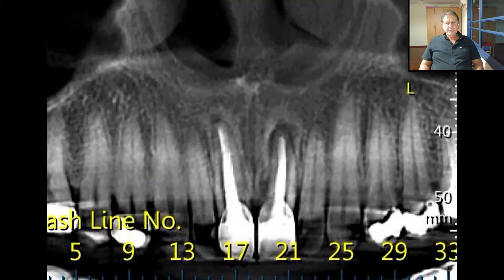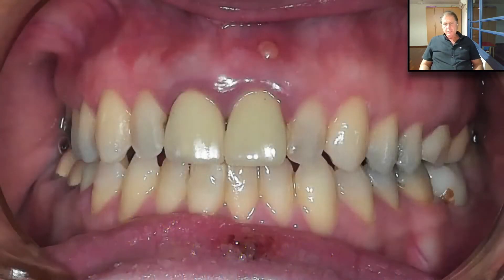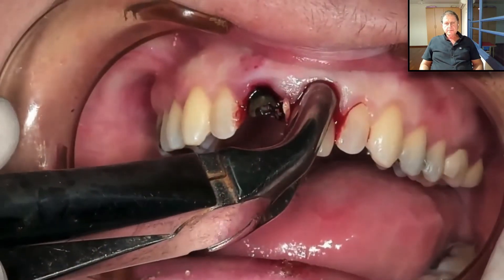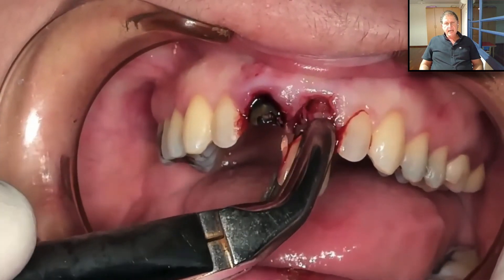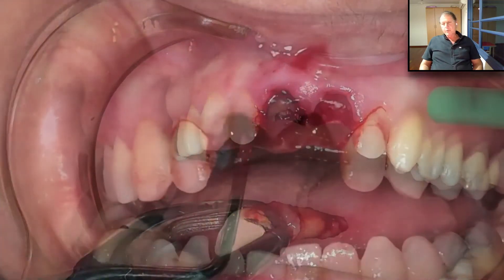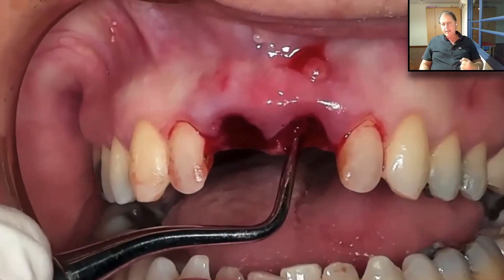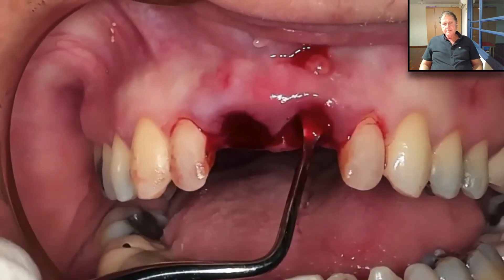Now that we know there is no need for collagen sponge support, let's see another video. We see a fistula and papilla and need to extract those two teeth. This is in the aesthetic zone with a high smile line, so we need to be very careful about the papilla. When we have a material that enables soft tissue to grow instead of borrowing it from somewhere else, you're going to see the result and how easily we can manage the case without any fear.